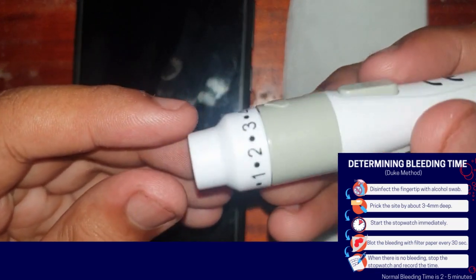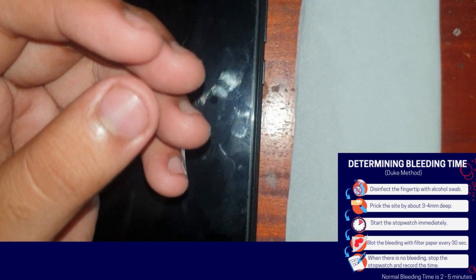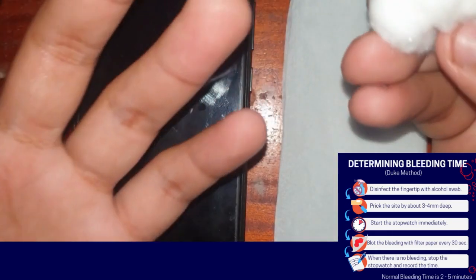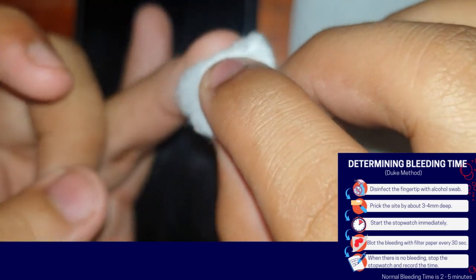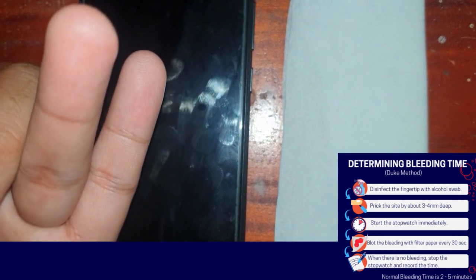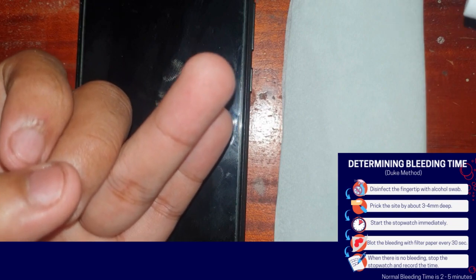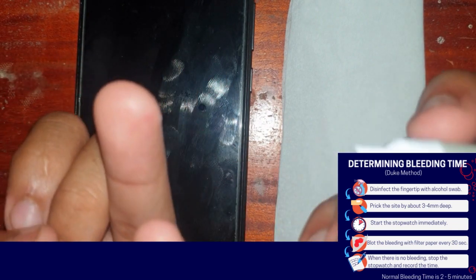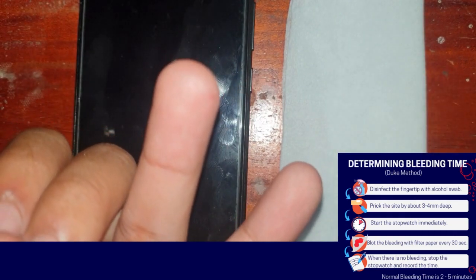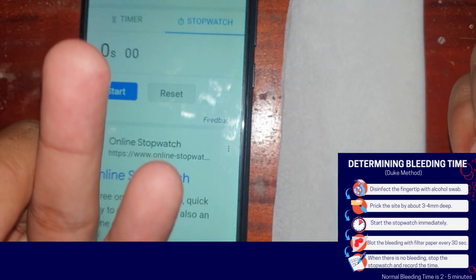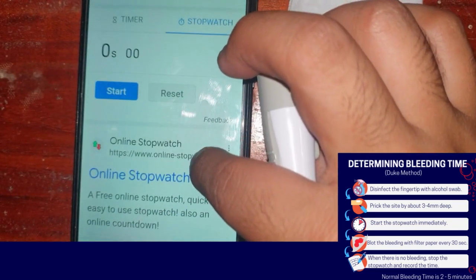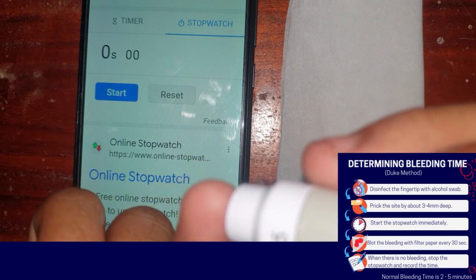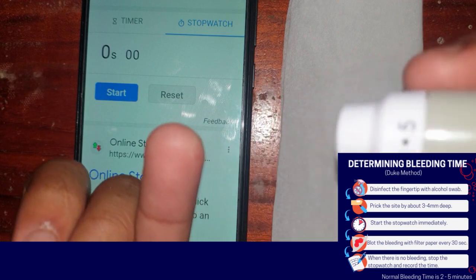You can choose between 3 and 4 millimeters. Then we must use an alcohol swab, apply disinfectant, and wipe our desired area to be punctured. We must choose the side of the ring finger. Before puncturing, we must ready our stopwatch and start it instantly as we puncture. Ready? 3, 2, 1. Start.